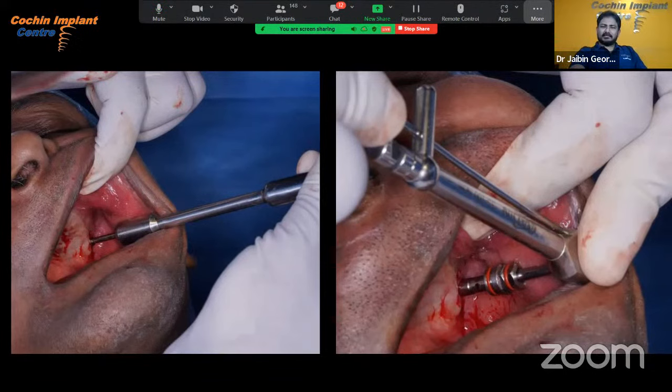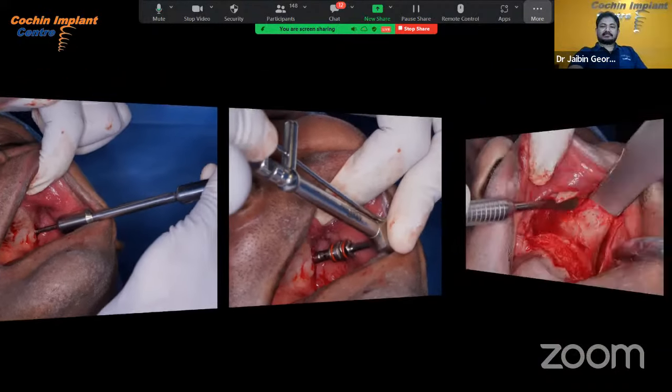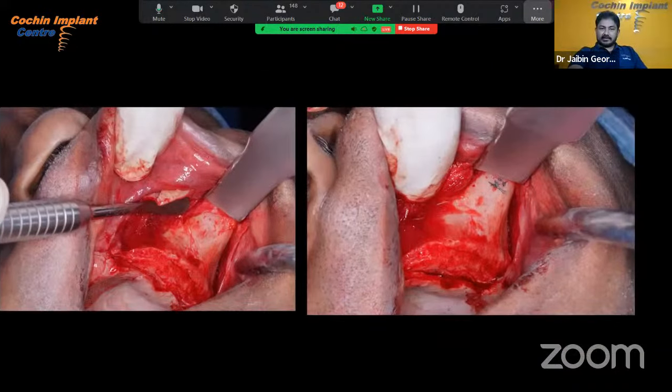And we could achieve good primary stability for this case. More than 60 newtons of stability we achieved for the pterygoids. That means we can load it immediately. Then we started with the zygoma.